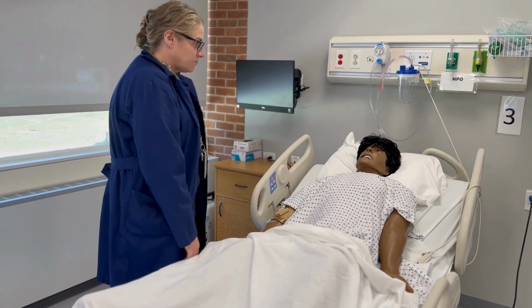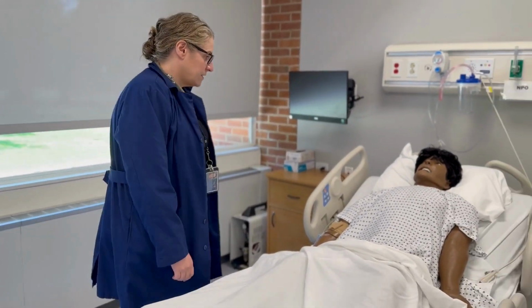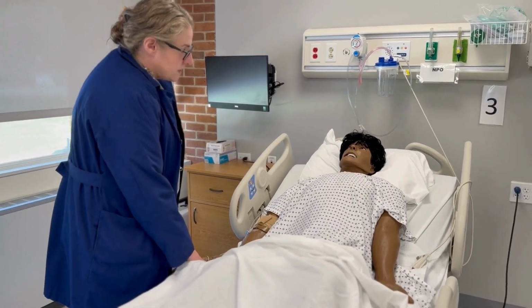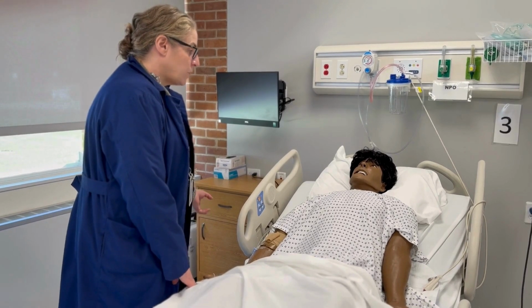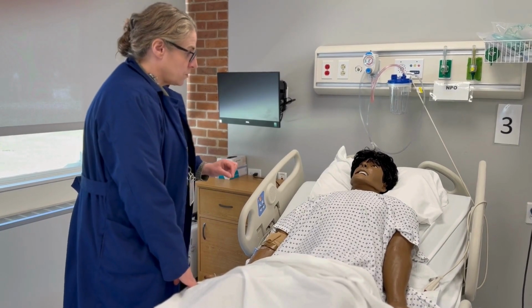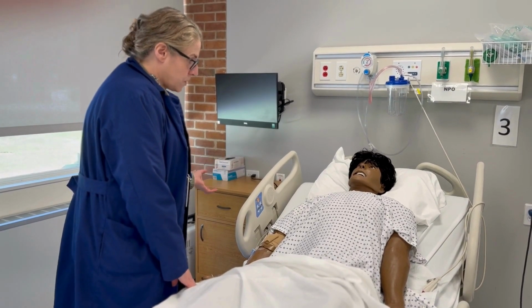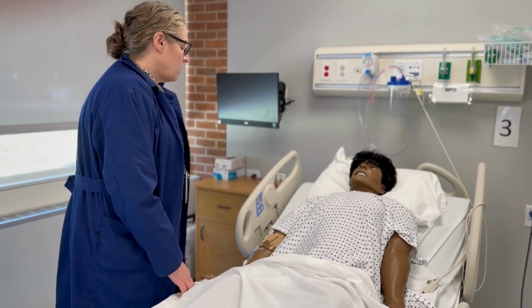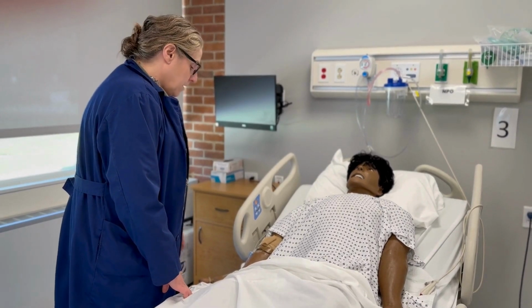Provide privacy for the patient. I'm going to go close the door. Explain the procedure to the patient. Sydney, the doctor really wants to keep close track of your urine output. And we are going to put in a tube into your bladder through your penis to keep track of every single drop of urine so that we can really make good decisions about your care. It's going to be a little bit uncomfortable, but we'll talk you through the whole thing.